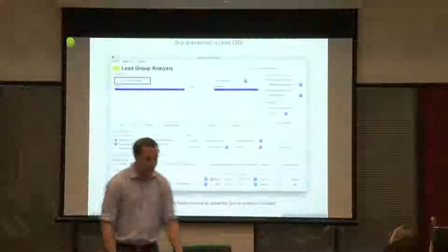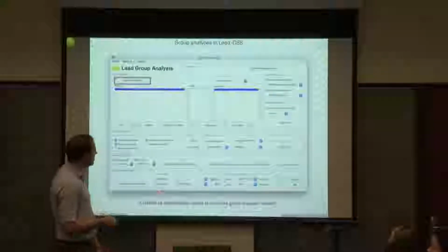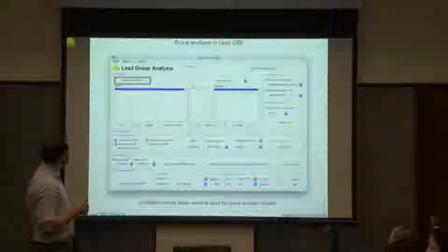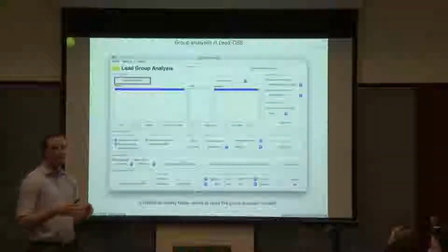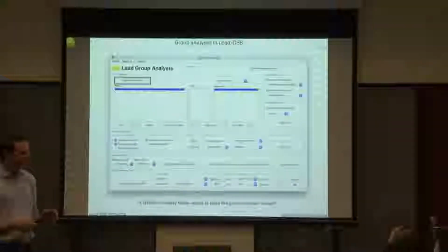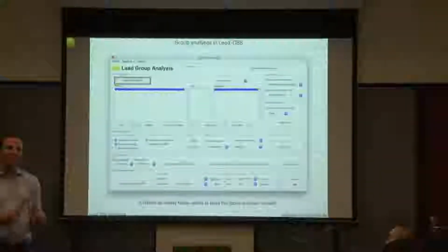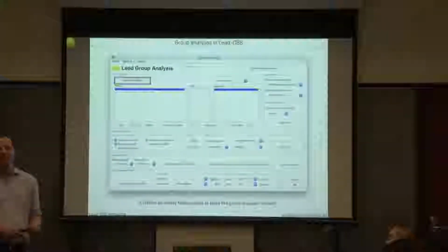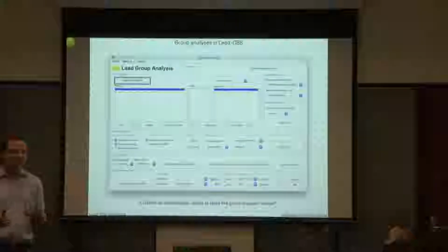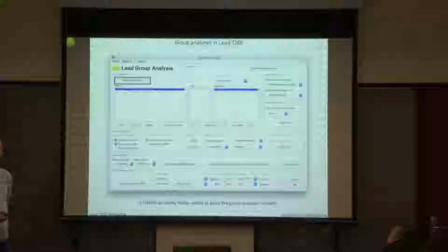And I plan to do this interactively. So I have basically a talk with slides which just show what we can do and go through some functions, and some may even not work right now, and we have to fix them then. Write us emails if functions don't work, or post it on the website, because usually they are pretty easy to fix. It's just some small thing that changed and we didn't notice. And usually we're quick in helping with broken pipelines as well.